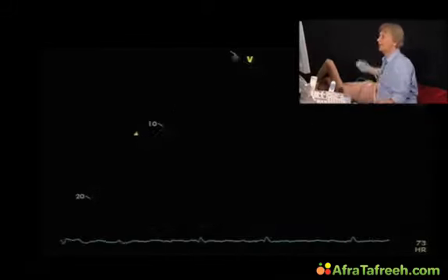then we can see a patient who has significantly reduced left ventricular function. He has a dilated cardiomyopathy, even though there are regional wall motion differences. And this patient is here because we are assessing him for heart transplantation.